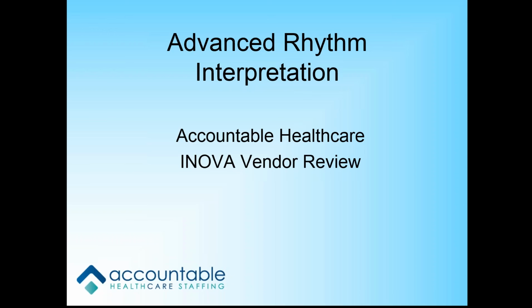Any other concerns going into this? No, it's just a little bit out of my comfort zone, so it's just studying and looking at it. Okay, perfect. Thanks, Crystal. Irene?